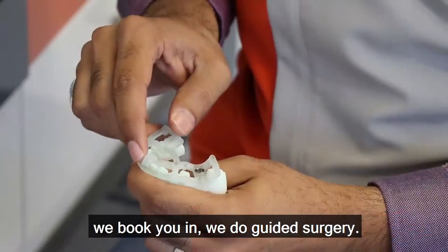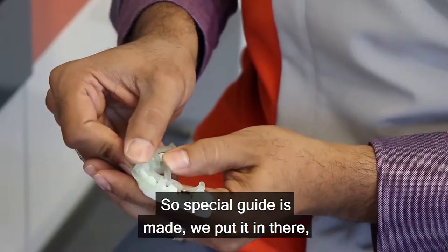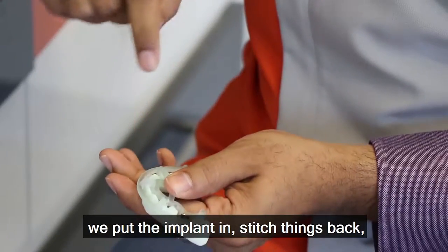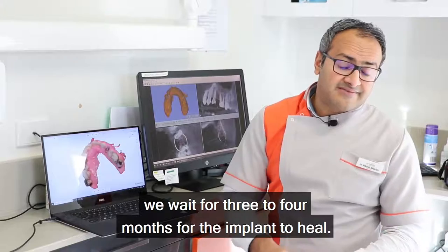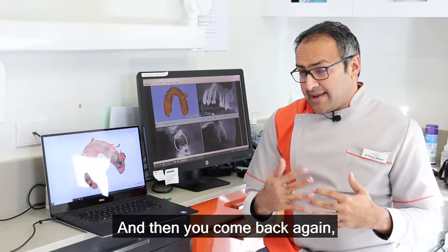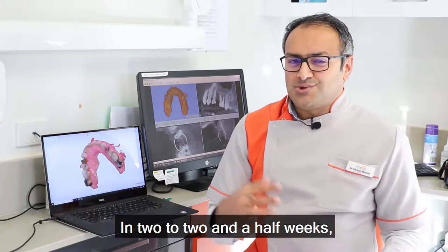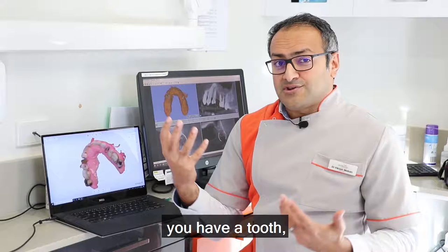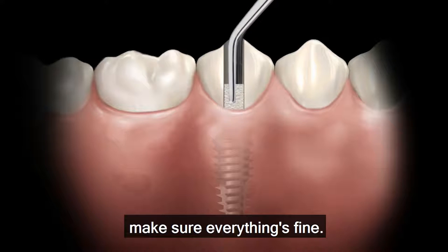We do guided surgery, so a special guide is made. We put the implant in and stitch things back. We then wait three to four months for the implant to heal. When you come back, we do another scan and send it to the lab. In two to two and a half weeks, you have a tooth — we screw the tooth into the implant and make sure everything's fine.